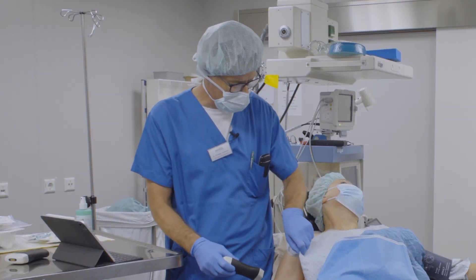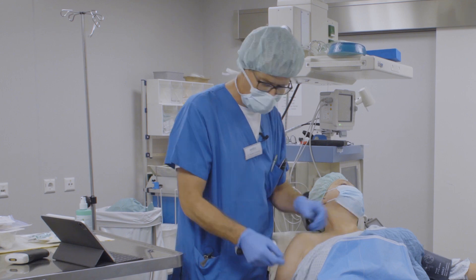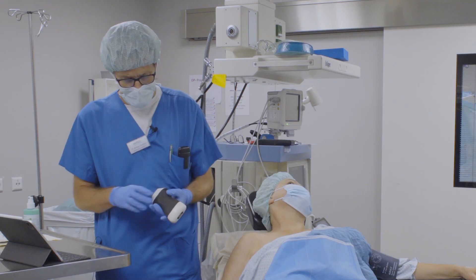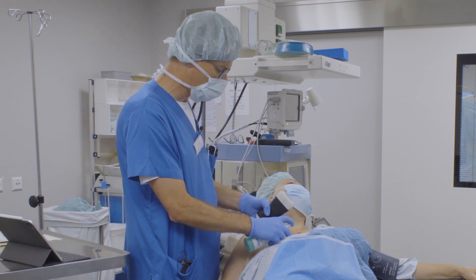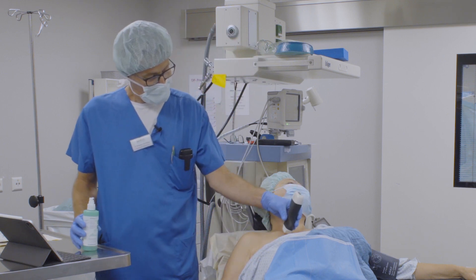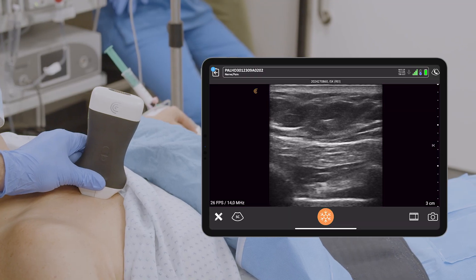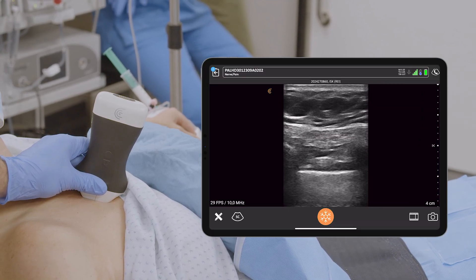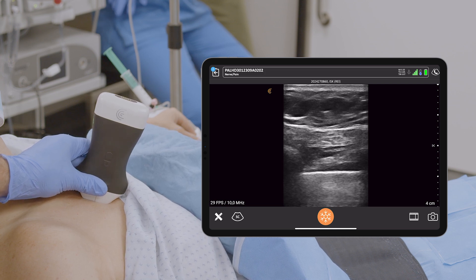With the same probe, we change the preset and switch to the linear probe. Using a nerve preset or lung preset, I can quickly look at the pleural window. We've got a standard window here. 'Increase depth.' Now we have the pleural sliding — wonderful, with a little comet tail artifact here.